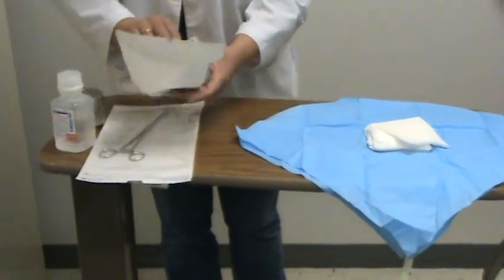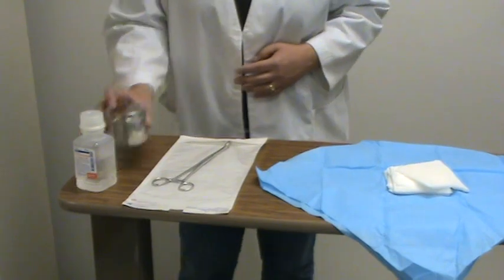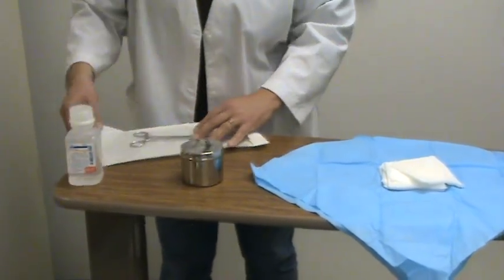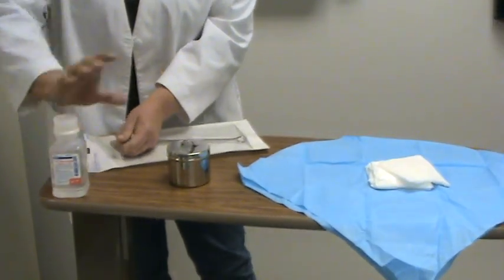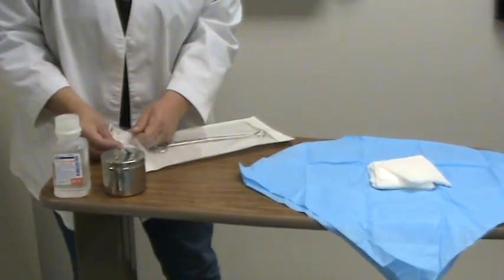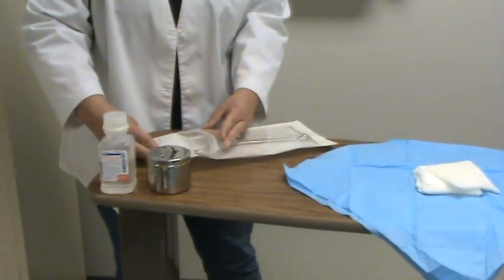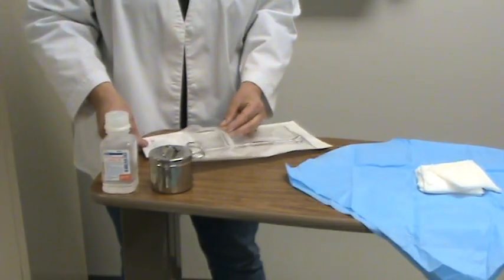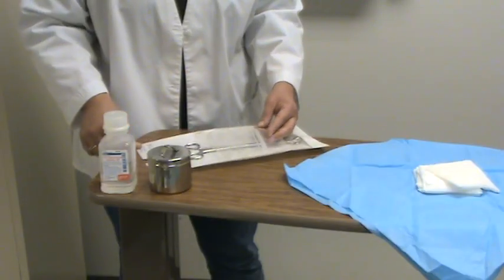The next thing I'm going to do is use my forceps and add some more 2x2s. We don't need gloves — we're opening all of these with sterile technique, knowing where I can touch and where I can't touch. The glue edge is always a good border.